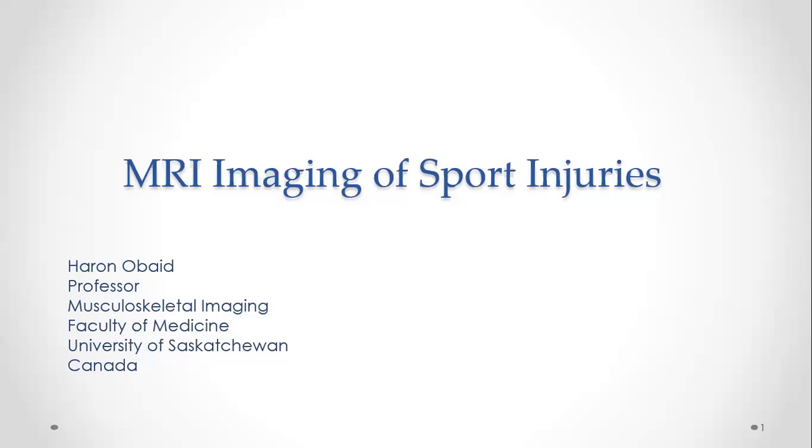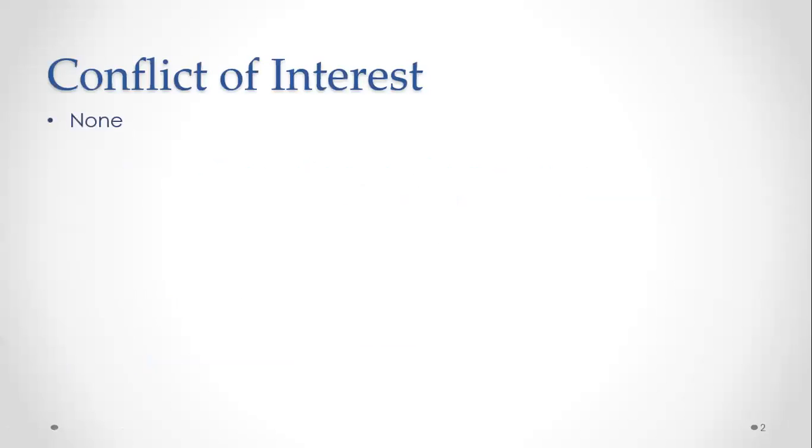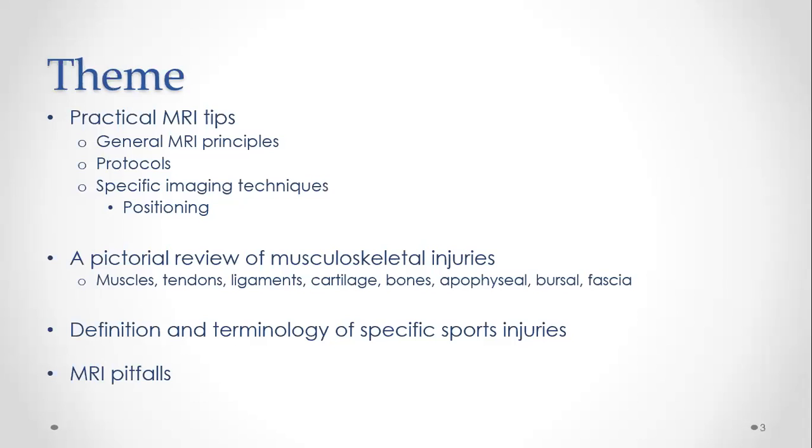I'm Haron Obaid. I'm a musculoskeletal radiologist at the University of Saskatchewan here in Canada. And today is really to share my experience with you in terms of how we do MRI imaging of sport injuries. The theme of this talk will center around some practical tips for optimizing your MRI imaging of sports injuries.